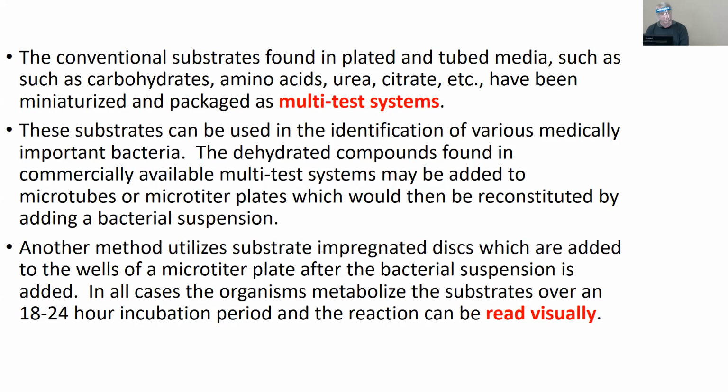So you can see the zones, but we do still run zones. I want you to think about how we still run Taxo A disc and P disc for our streps. There are some others, but for the most part the antimicrobial setup is in the panel, but we still add those to our growth just to see.